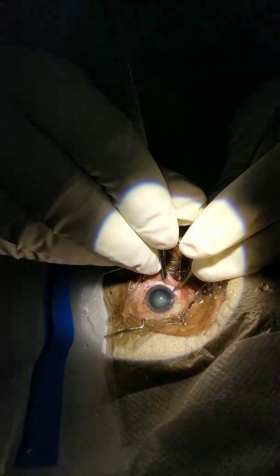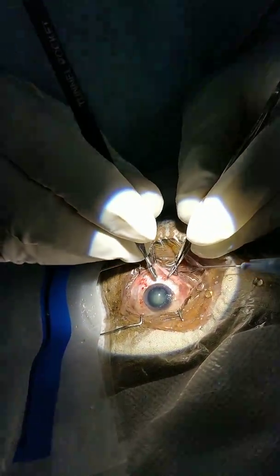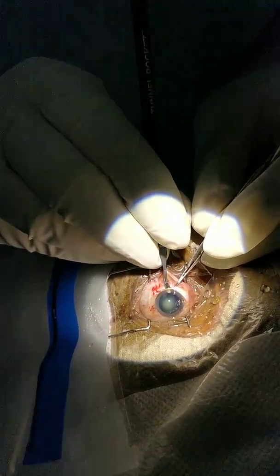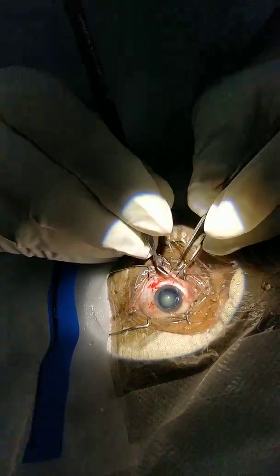I am giving the incision and two back cuts to make very less astigmatism and a very good result at the end of the surgery. Doing the tunnel — the tunnel is a triplanar tunnel. The merit of the triplanar tunnel is it does not require any suturing.